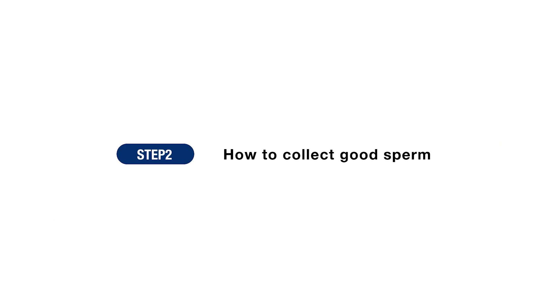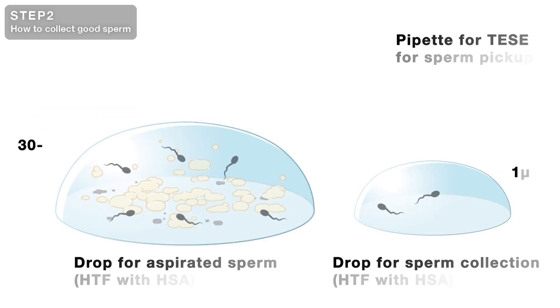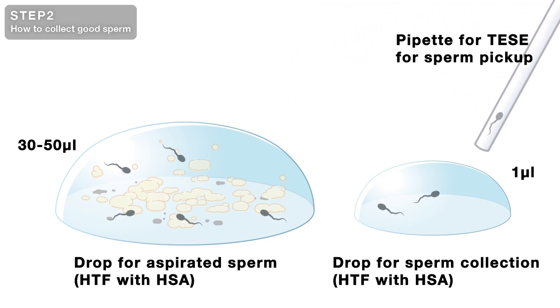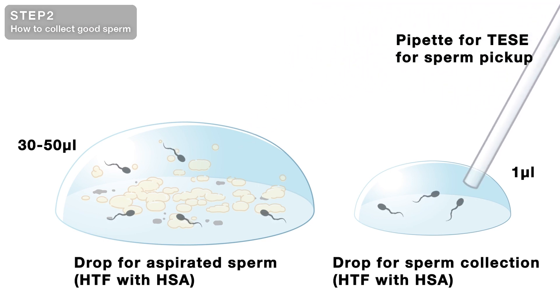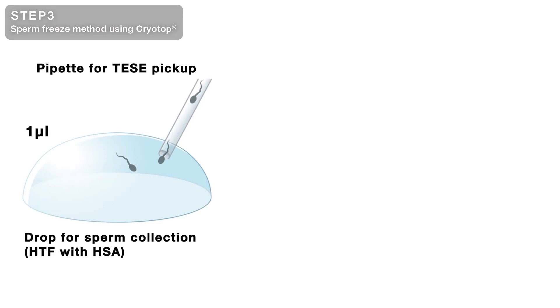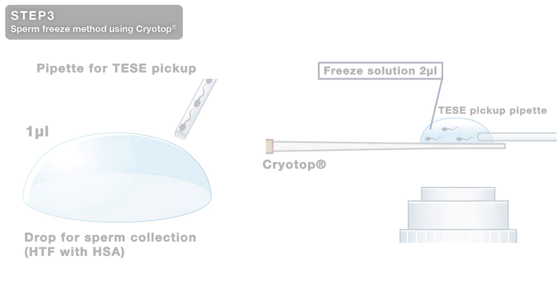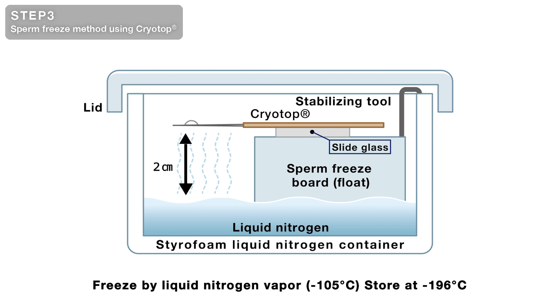Step 2 shows how to collect good sperm. This is a procedure to aspirate good sperm with a TessiSperm pickup pipette and transfer them into a collection drop. Step 3 introduces the sperm freeze method using CryoTop. From the collection drop, aspirate the sperm from the tail with a pipette and transfer them to the sperm freeze solution prepared on CryoTop. Immediately place the CryoTop on a float or sperm freeze board and expose it to liquid nitrogen vapor.